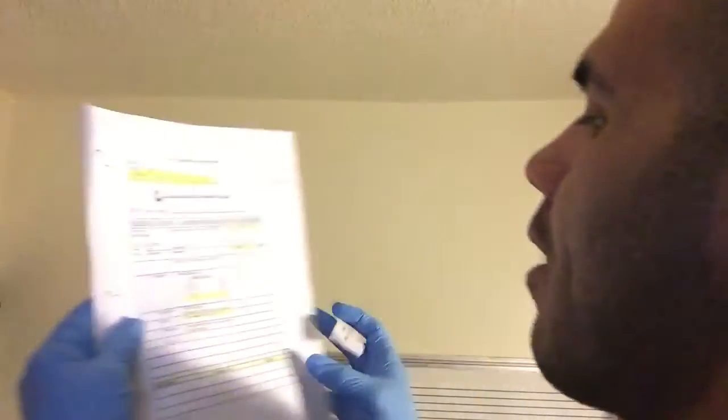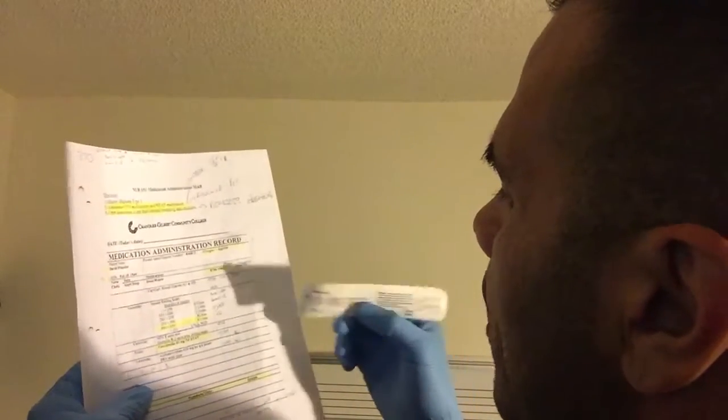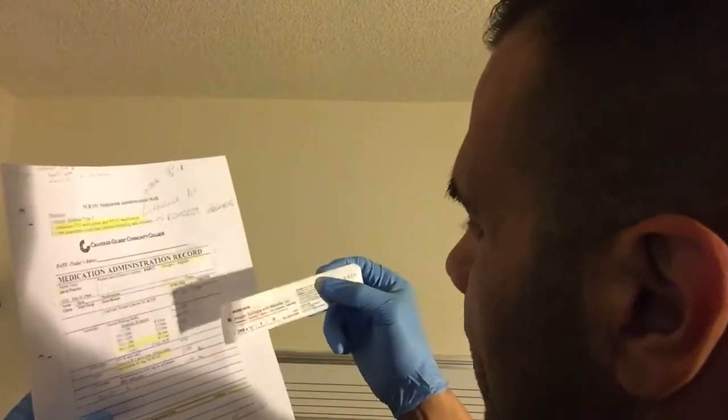So again, I'm just going to refer back to the MAR, and it looks like our MAR says that we're going to be administering 8 units of NPH and 6 units of R. So I'm just going to verify with the medication that I prepared to my MAR. Everything matches up. I have the correct medication. And our insulin is a subcutaneous injection. So we're going to do the abdomen.